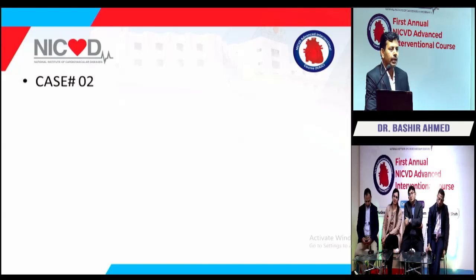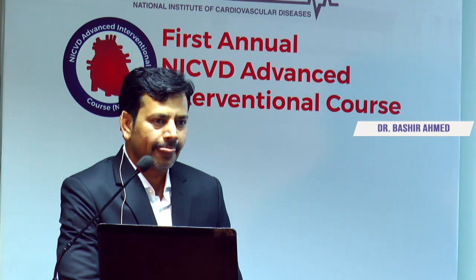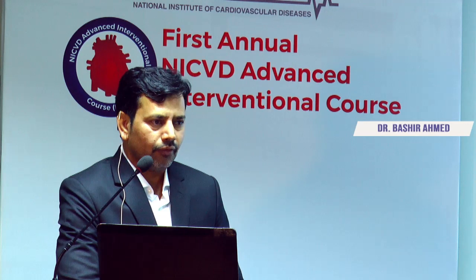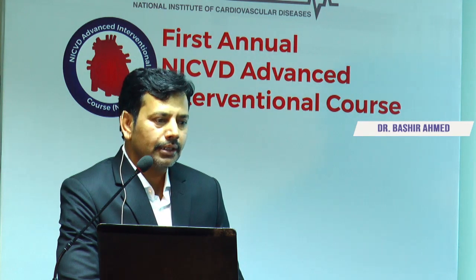Sequential balloon was done, and there was some complication in that. After dealing with that complication, pre-dilatation was done even with a 3.0 balloon, but the stent couldn't cross the calcified lesion. So the procedure was deferred at that time without any complications.